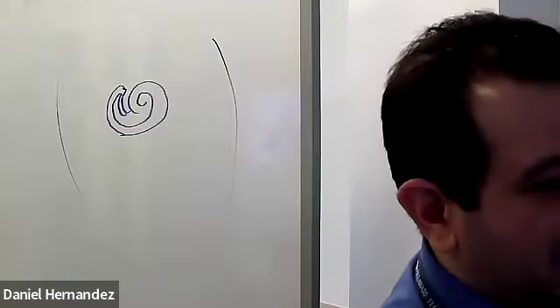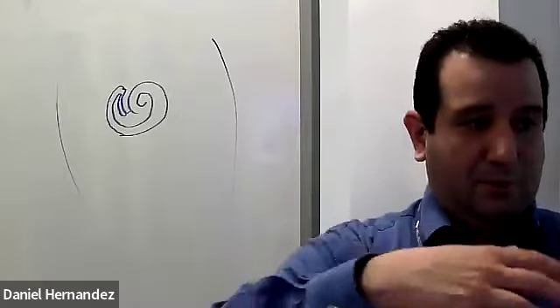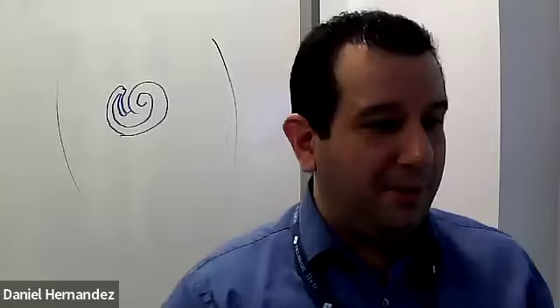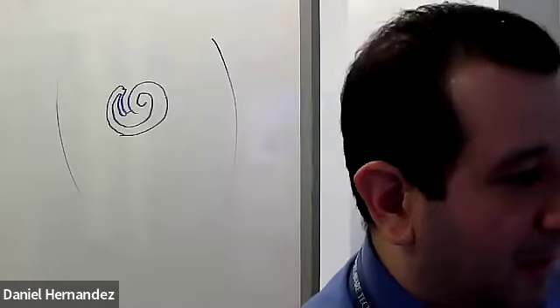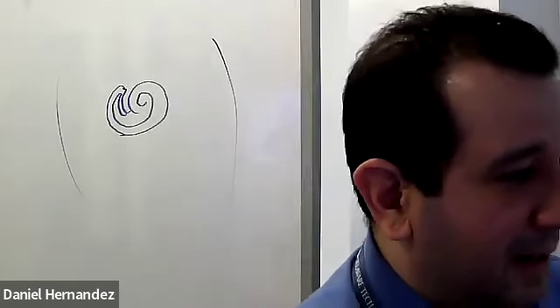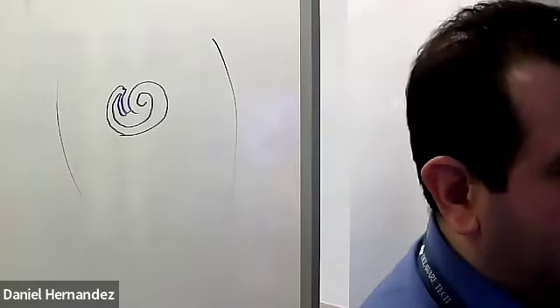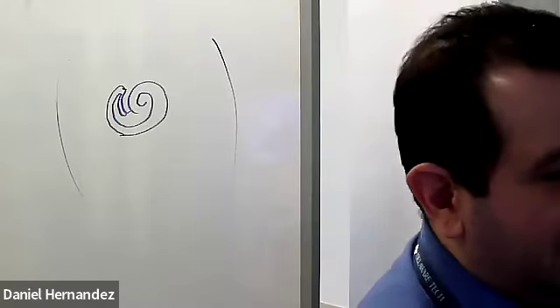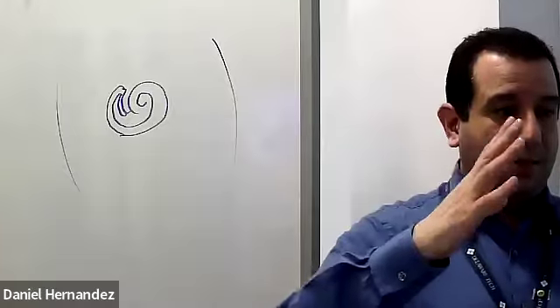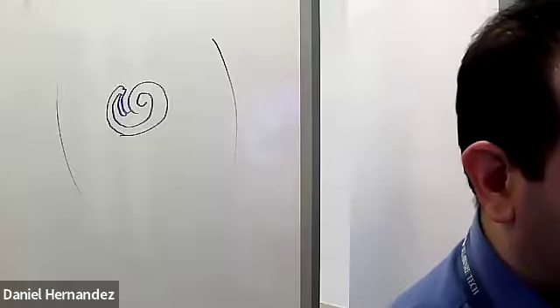And that's the part that thickens and grows backwards towards the distal antrum. So again, this will open up, allow for food to pass through. You can really see it almost open like a mouth as the stomach contents pass through. So you're going to sit over this area. This is your money shot. This is what you're trying to assess and evaluate. So you stay over this area, watching in real time to see it gradually open, stuff pass through, and then close back down. And you want to capture that on a cine clip.